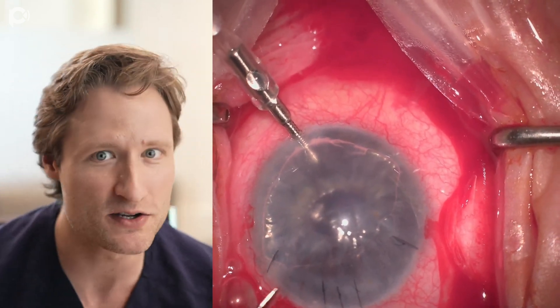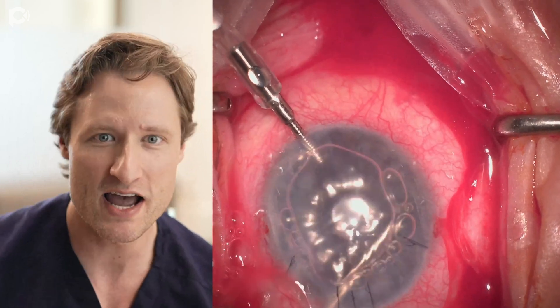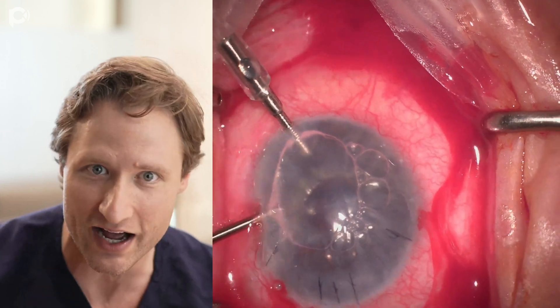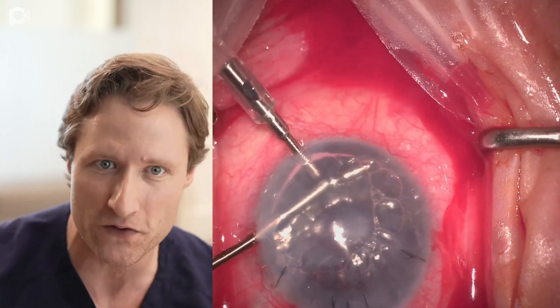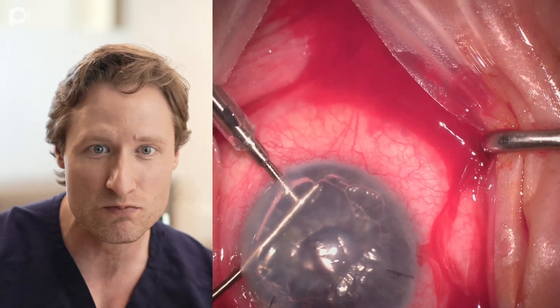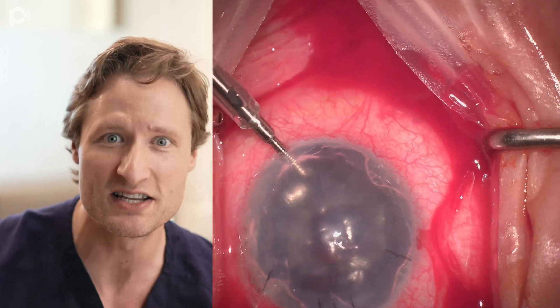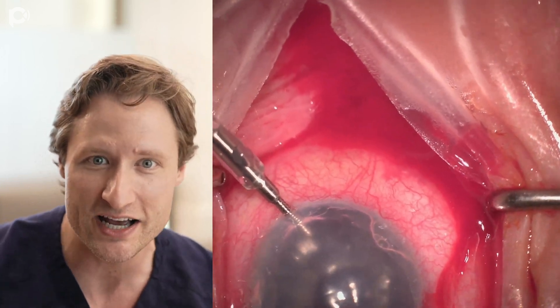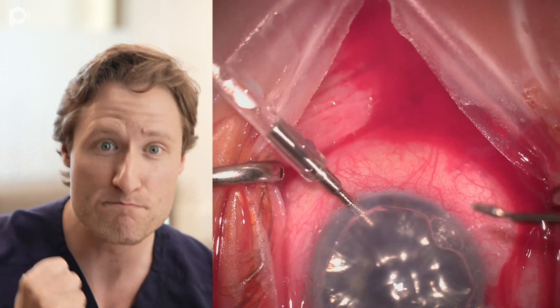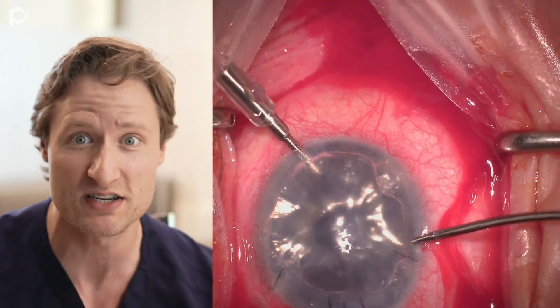This can be very severe. Sometimes you have massive zonular loss and even the whole IOL is tilting up. You can sometimes see the edge of the IOL coming up into focus through even a constricted pupil because it's being lifted up by all of these bubbles that sneak back there. Eyes with tube shunts have shallow anterior chambers with misdirection of air or aqueous through missing zonules.